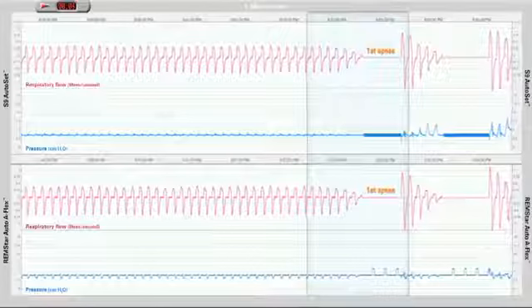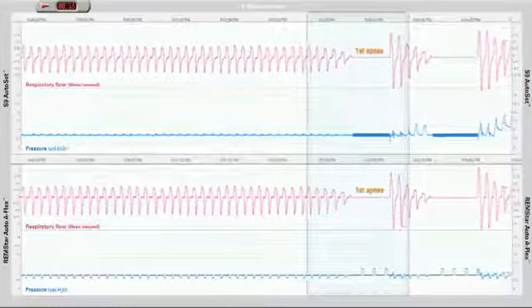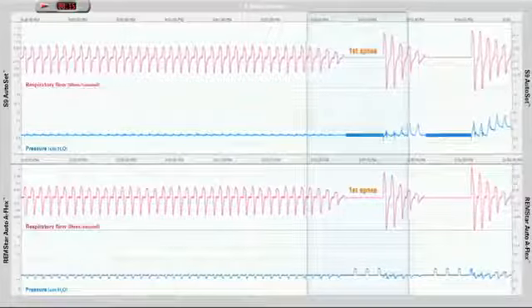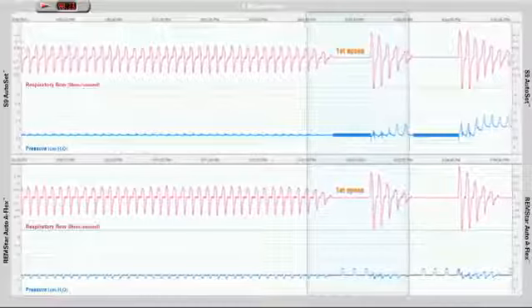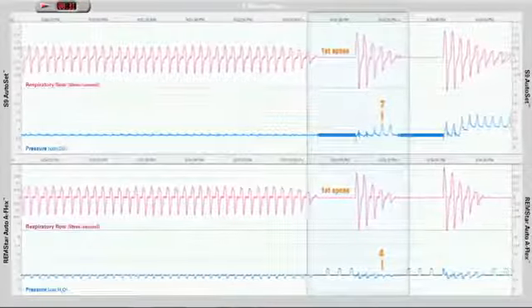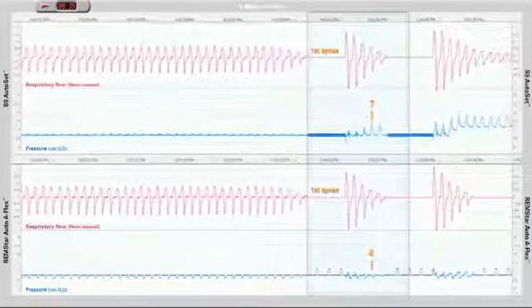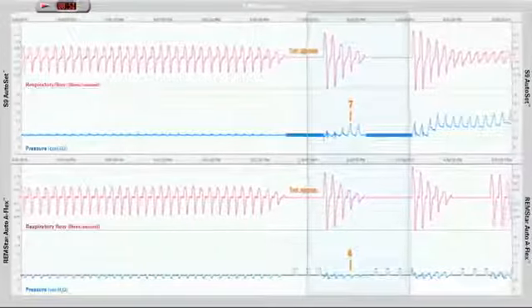The S9 AutoSet detects that the apnea is obstructive and responds by increasing the treatment pressure by approximately 3 centimeters to 7 centimeters. The REMstar Auto detects that this event is obstructive, yet shows no response to this first apnea. Both patients have a second obstructive event.